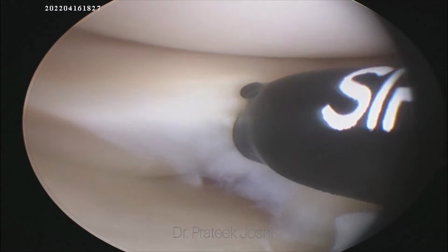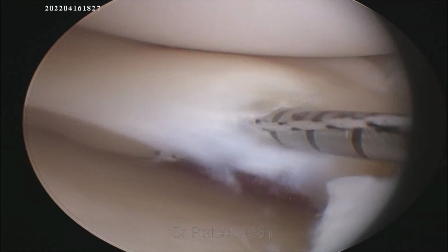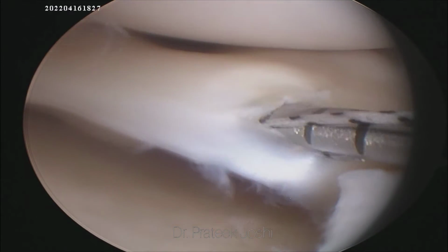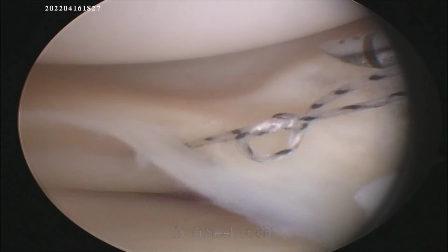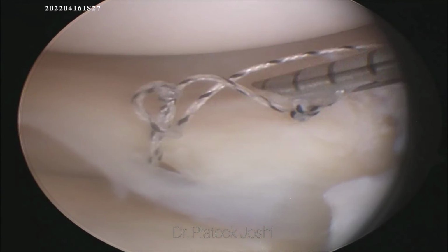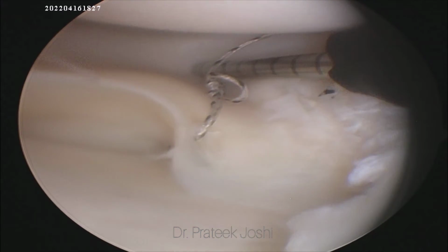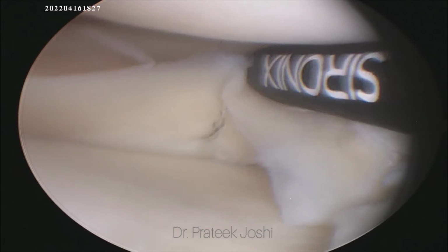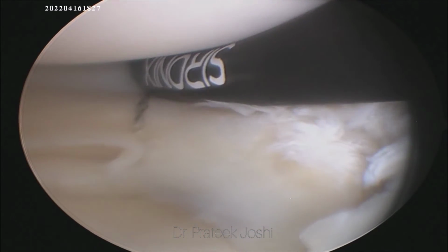After deploying the first implant, we are going to gently withdraw our all inside device. So now we are going to pierce the needle second time to deploy the second implant.